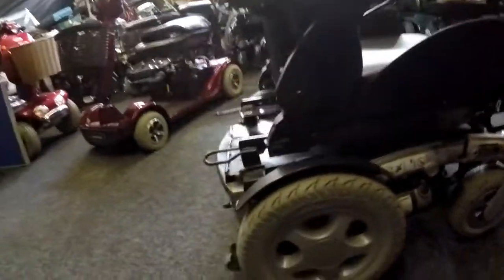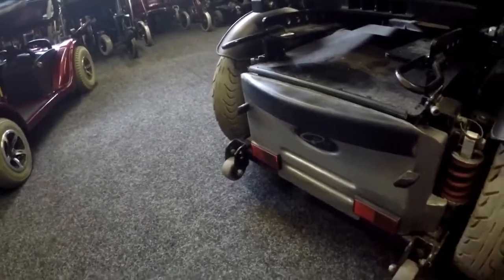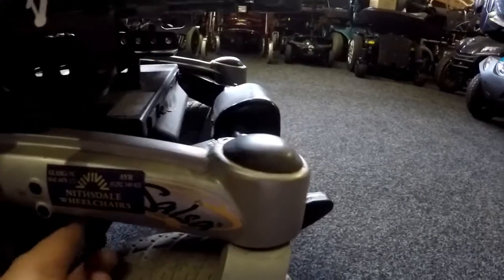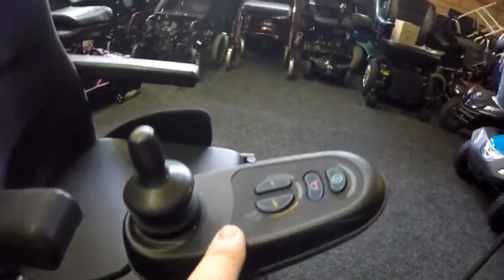Gain access to the batteries in this particular product is at the back there. Undo these screws here, lift the panel off, and the batteries will slide out the back. So let's see if I can find the cable. Oh, there's a cable, there's a connection here for the VR2 controller.